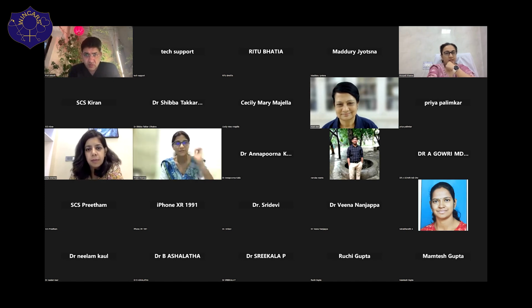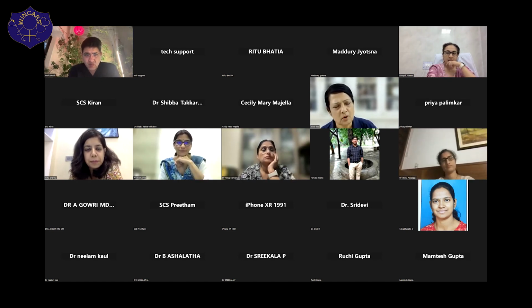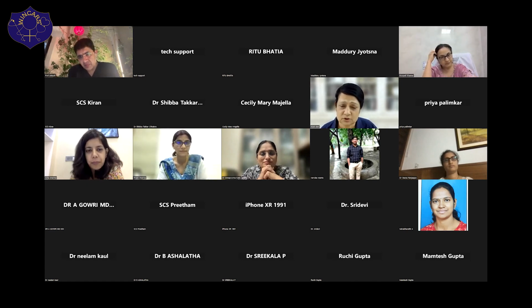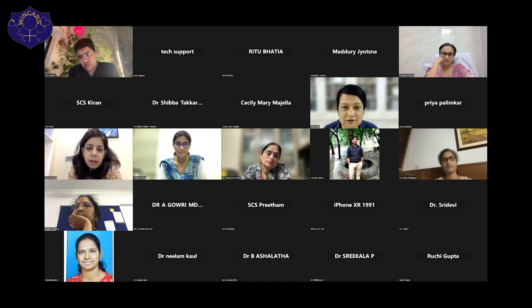Nice case, Richa, nicely managed. Excellent, Richa. You did very well. There were so many long nodules. I was thinking all the while that probably the next step you would take is either orbital or rota, because of those chunks of nodules, and you have demonstrated it so well in your OCT pictures and the length. I don't know exactly what modality would be the best, but in my consensus, I would think about these two modalities as the better choice for shaving out those chunks.